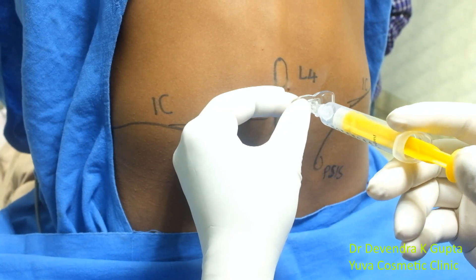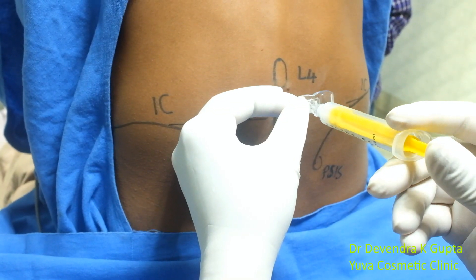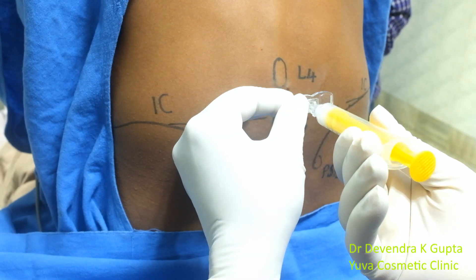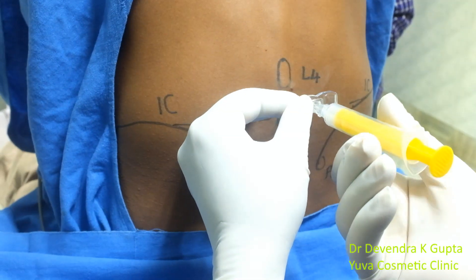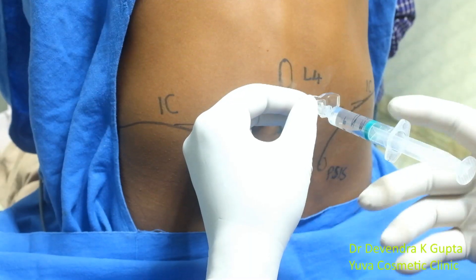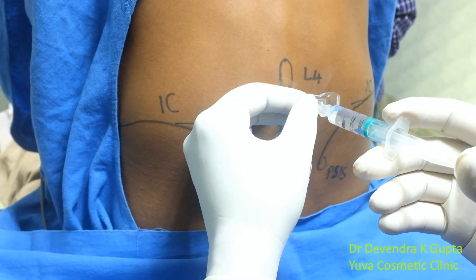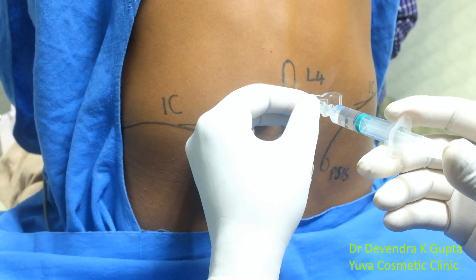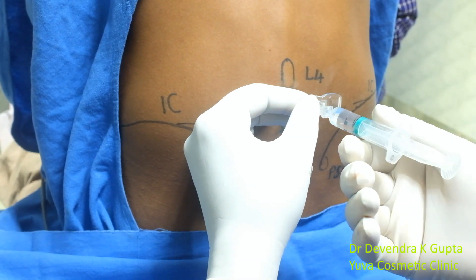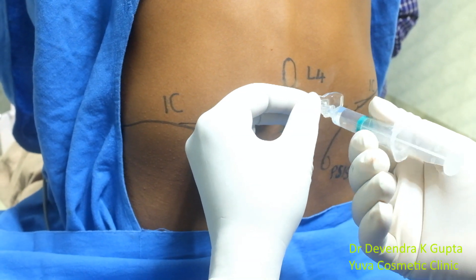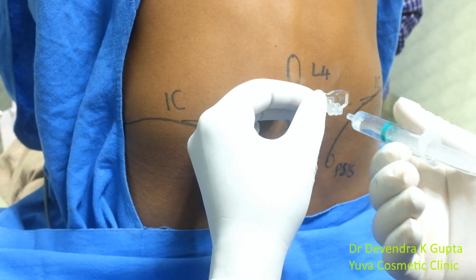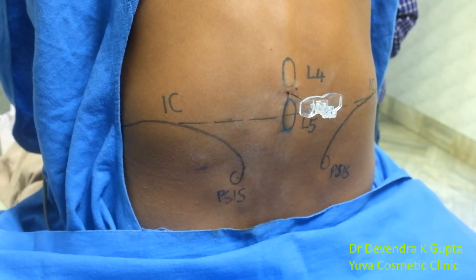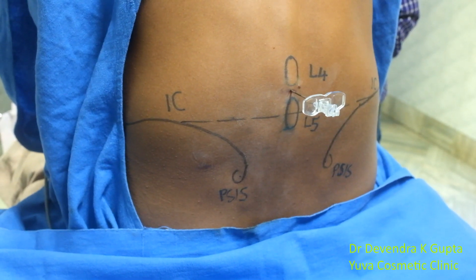There is a loss of resistance here. I just disconnect it — see, this is free flowing. Now I will insert the catheter.